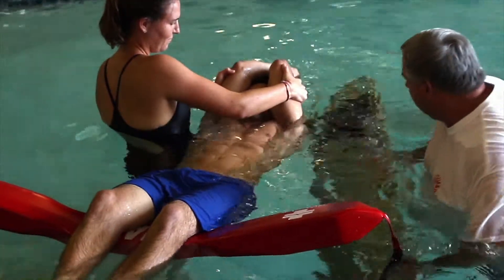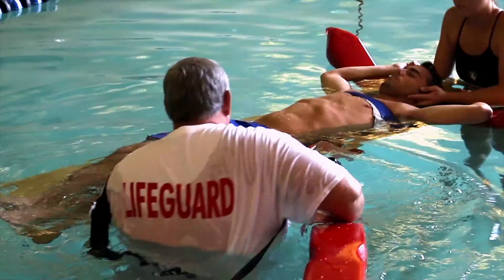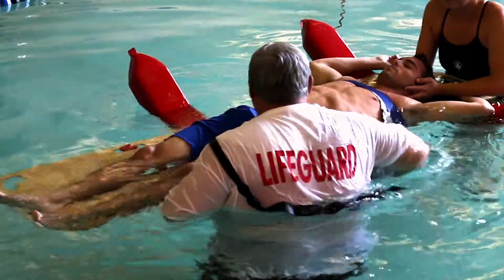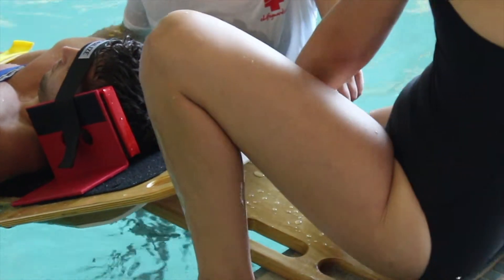The revolutionary new Immobilize 6000 backboard is uniquely designed and handmade using special polyurethane coated marine grade plywood. A one-of-a-kind proprietary Immobilize deck paddle improves aquatic rescue speed and efficiency.